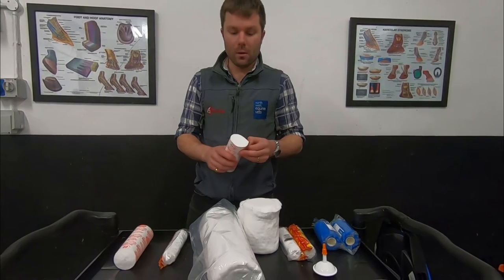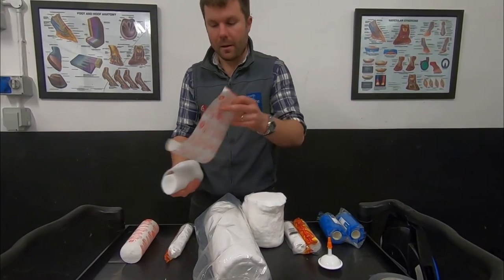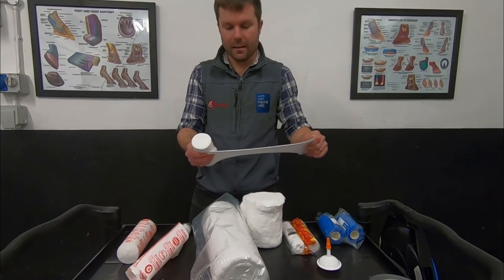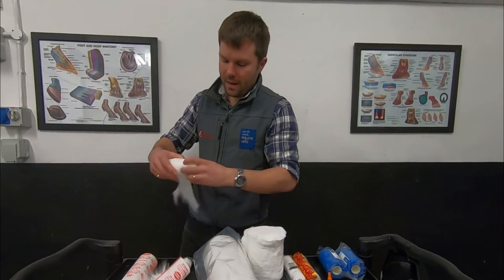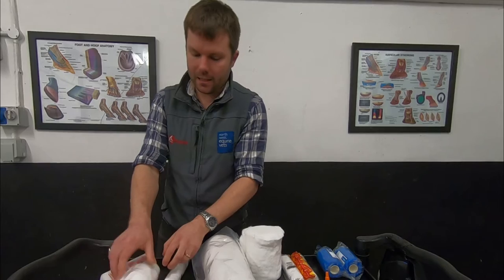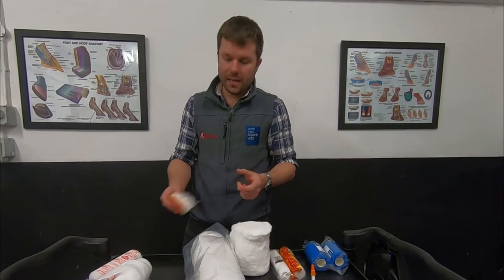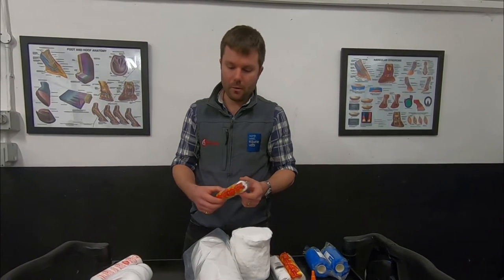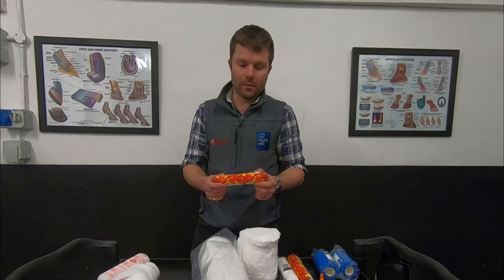Effectively it's a thin roll of cotton wool that's sterile when you unwrap it, approximately three metres long and relatively tight, but you can tear it if you need to make it shorter. Having applied one or two layers of ortho band, apply a small bit of tension with an elasticated layer to keep those on the leg — you don't want them falling off if the horse moves halfway through. But the key here is not to put this on too tight; you can apply too much pressure too quickly and get pressure sores within a few hours.